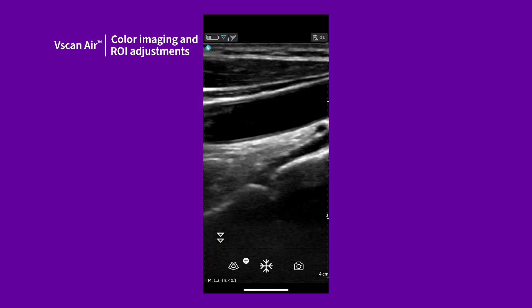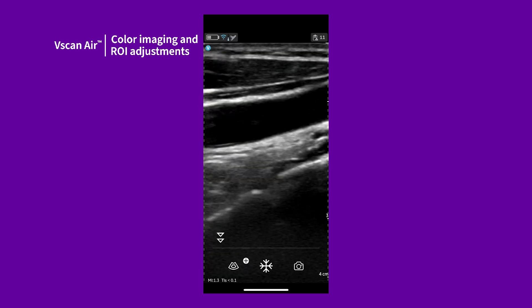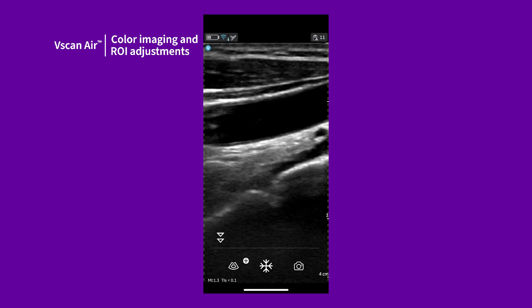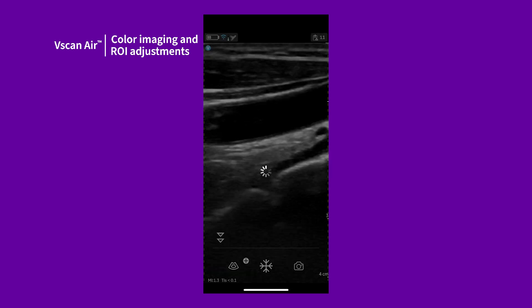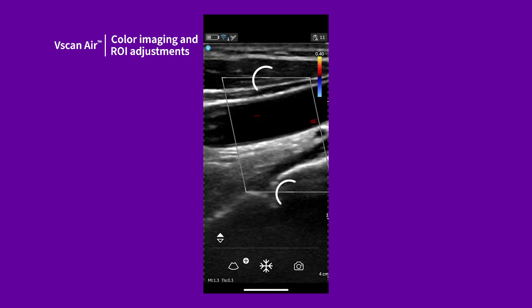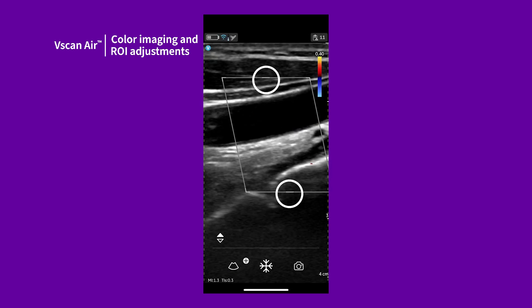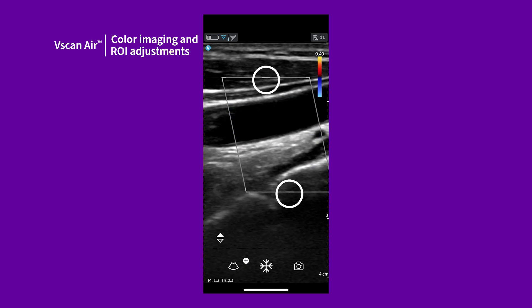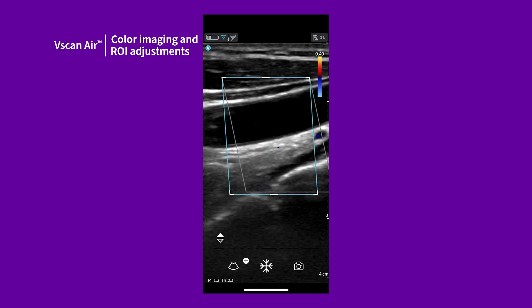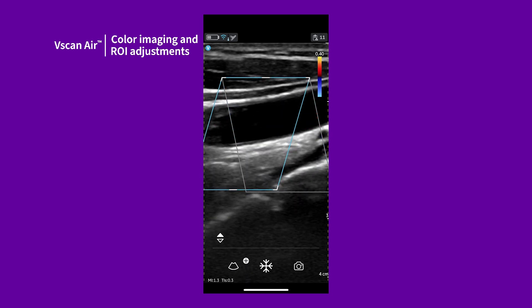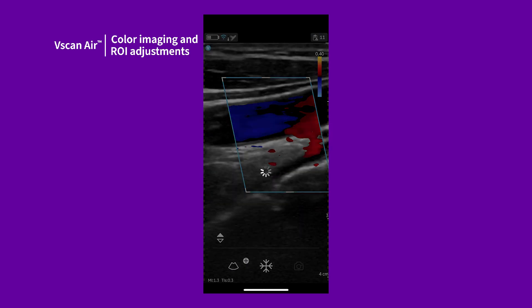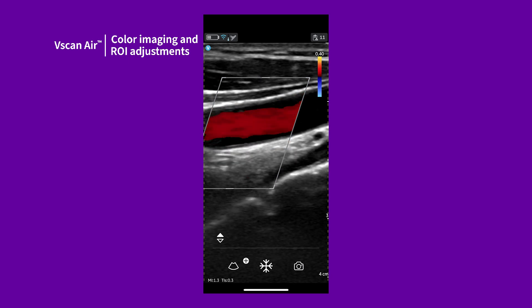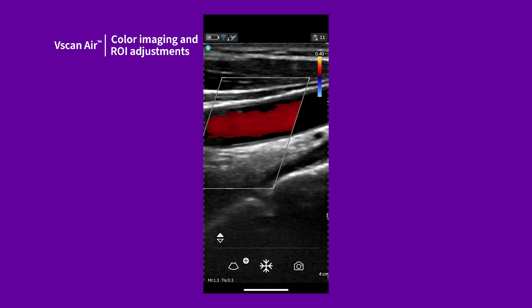There are additional controls for steering of the color box when using the linear array transducer. Use the controls on the middle, top, and bottom of the ROI to slant the color flow acoustic beam for a Doppler angle according to the transducer orientation.